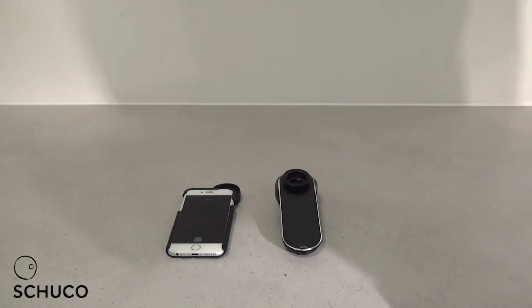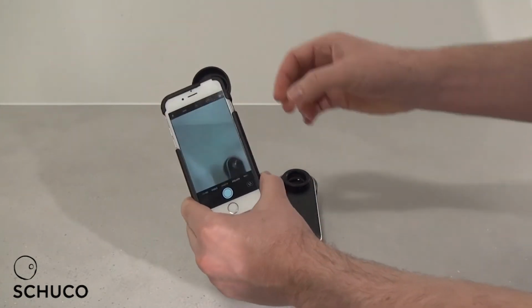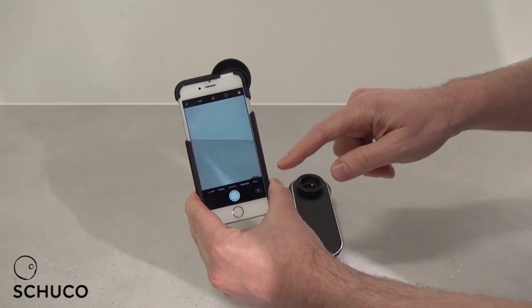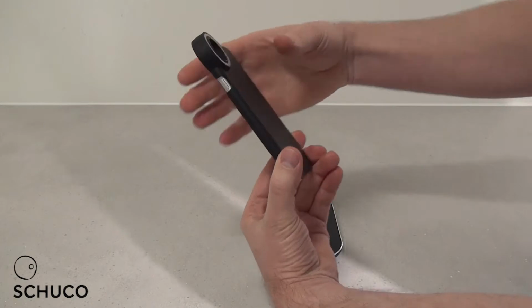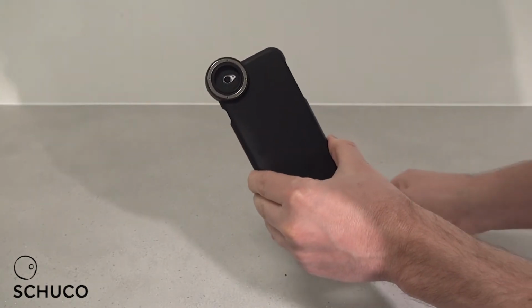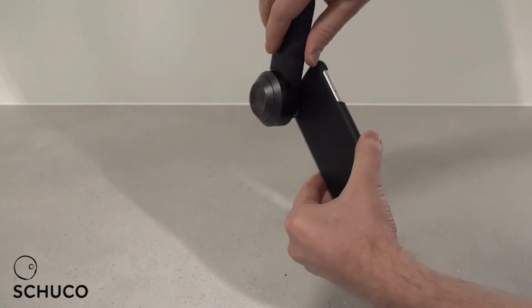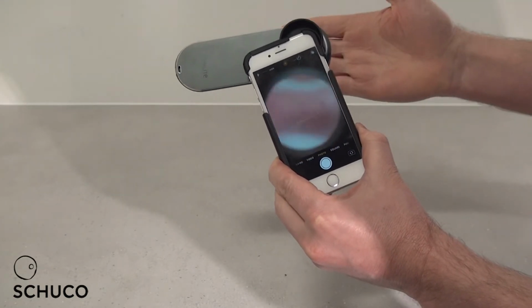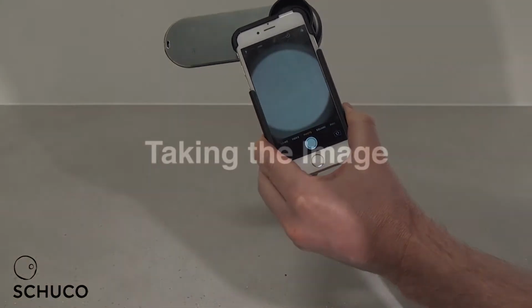So I'm now going to talk to you about your iPod and connecting it to the dermatoscope itself. It comes with a connector device that just slides onto the iPod, and on the back you can see a magnetic ring that directly attaches to the dermatoscope, like that. You are then able to see the dermatoscope image on the iPod.